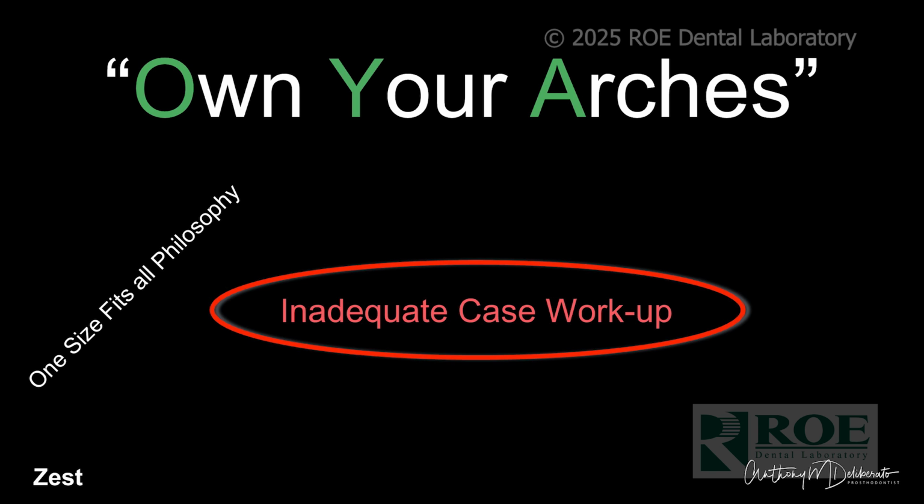The next thing I see that causes problems where you're not owning your arches is inadequate case workup, skipping all these steps that I've showed you on a couple of these cases.